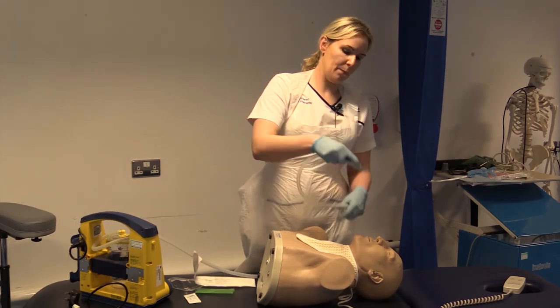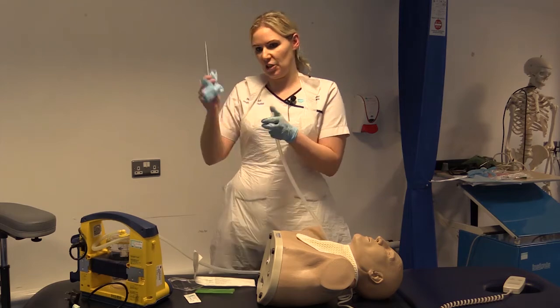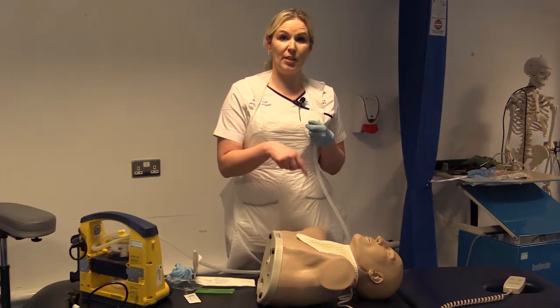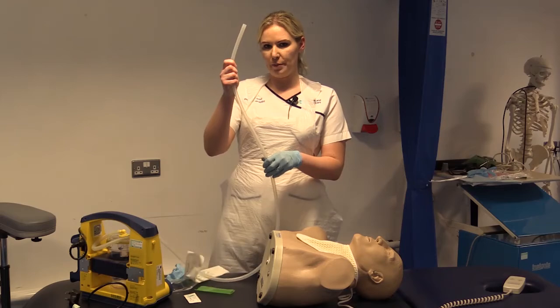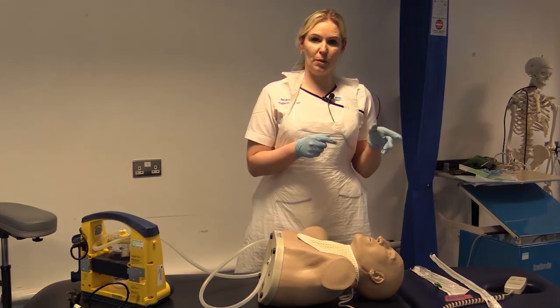Okay. And then you're going to discard your Yankauer catheter by pulling the lower end of your glove over the Yankauer catheter and just discarding of that in the bin. You're going to reattach your oxygen, and you're going to reassess your patient and make sure their clinical obs are returning to normal. You're going to flush out your suction tubing, and you're going to remove your PPE and wash your hands.